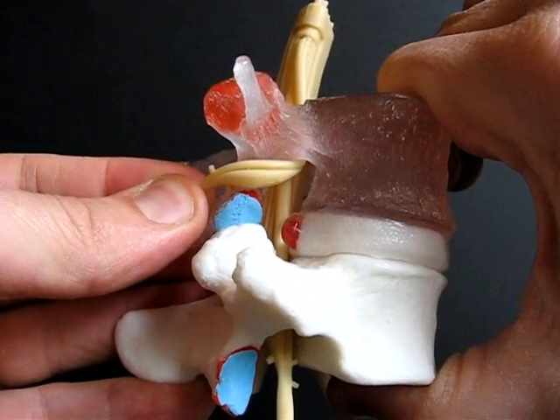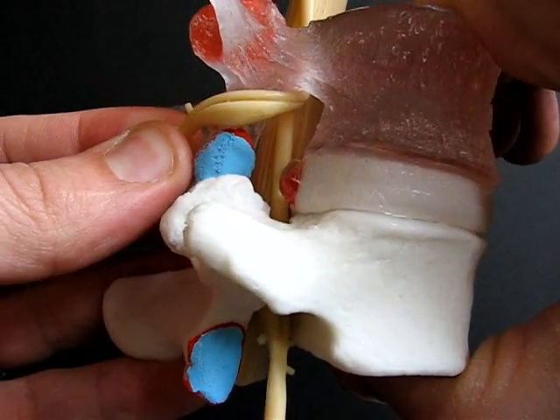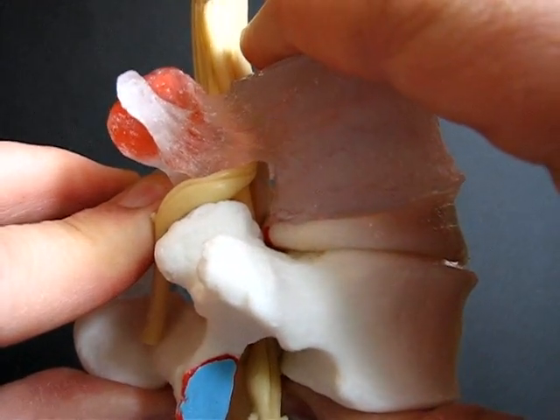I recommend extruding the nucleus 5-7mm and then allow it to retract back into position. Dynamic disc bulging can also be demonstrated with more neutral loading.